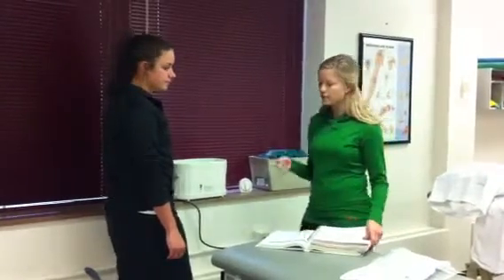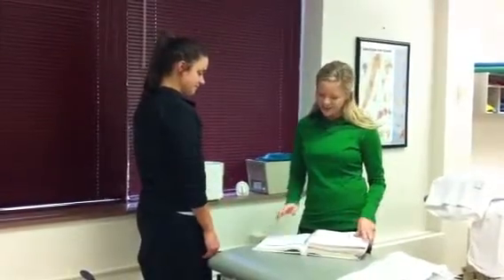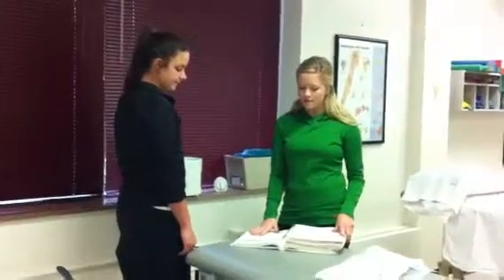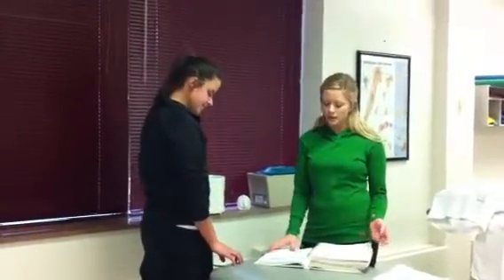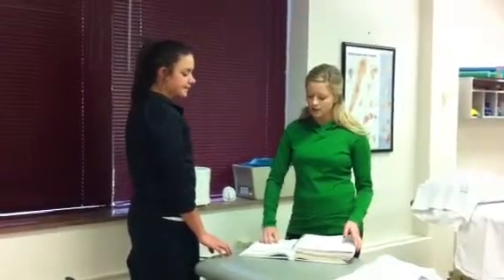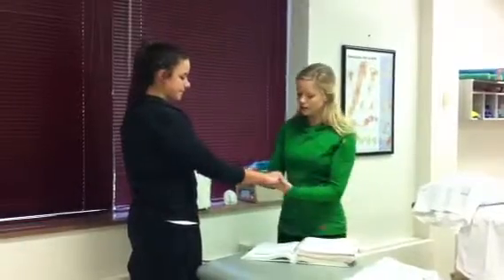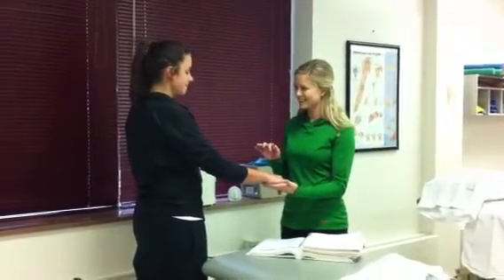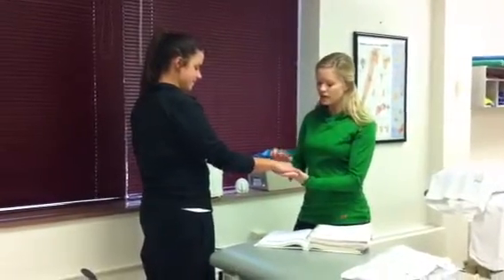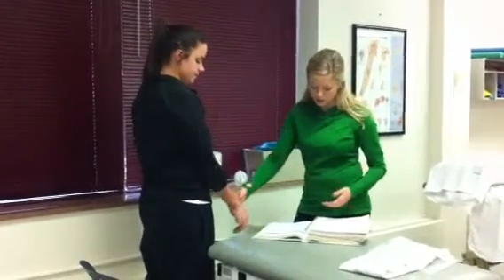You want to check the patient to make sure that she doesn't have any open wounds, which she doesn't. Make sure that she doesn't have any contraindications, which would be lack of normal temperature sensibility, some sort of peripheral vascular disease, or any tumors. We'll go ahead and check her sensation — do you feel that? And then we're going to check her hand and make sure that her vascular circulation looks okay, and it looks pretty good.